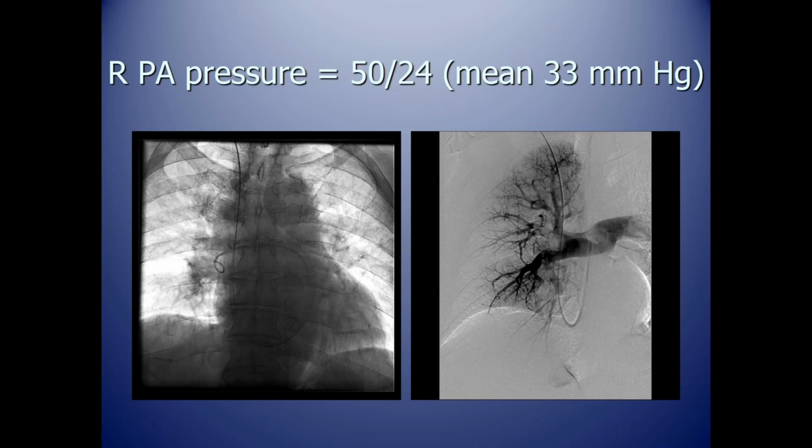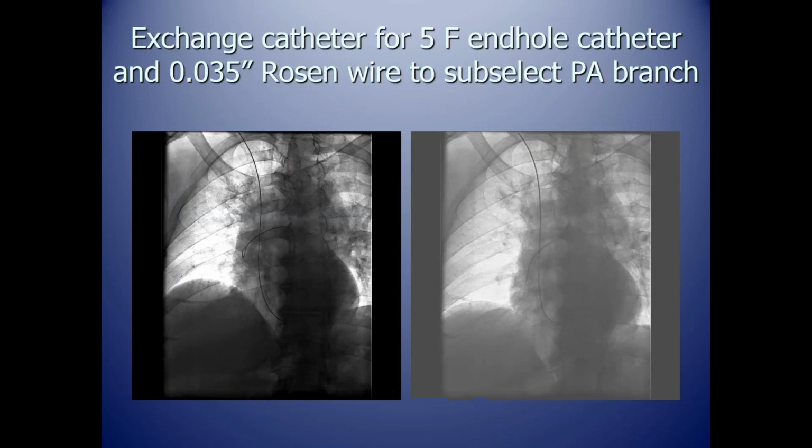And when you have obstructive clot, you really don't need the power injector to do your run. The only times we've used that is when we're prescribed to do that in different trials we've been participating in. But otherwise, it's just a 10 cc syringe with a contrast injection, and certainly measure pressures.